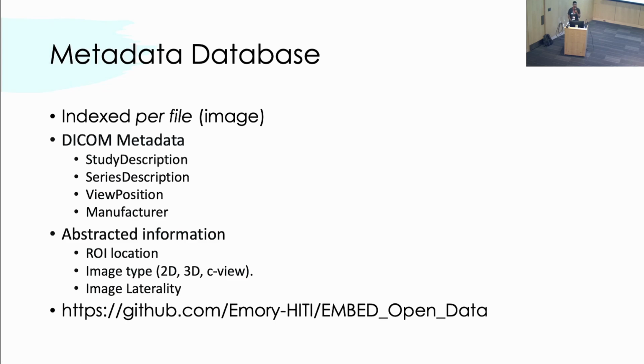So, DICOM metadata. Okay, so the metadata file is actually pretty simple. A DICOM file is a container, right, of the image plus all the metadata. So in this metadata file is all of those DICOM tags, not all 1,000 of them, but about 200 of the DICOM metadata tags that were in the files. So every row in the DICOM metadata table is one file, okay?